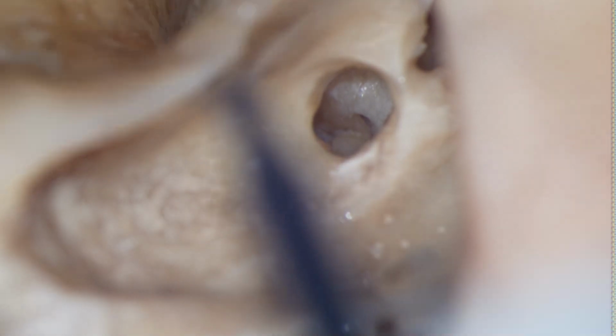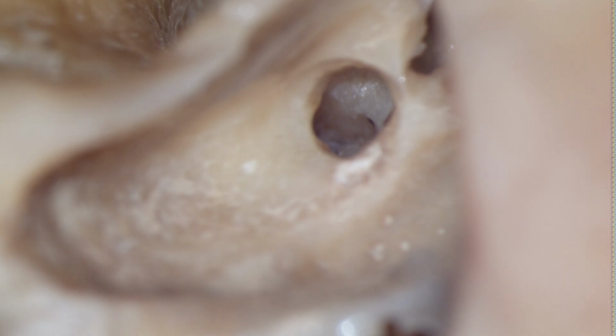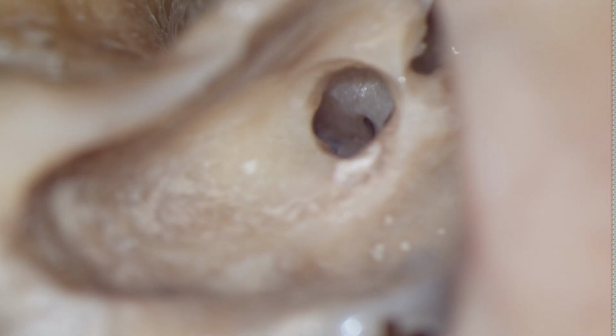Okay, so we'll stop here. I think you can start with the dissection. You can do a cortical mastoidectomy and do a posterior tympanotomy and identify the round window membrane, and then you can do a posterior canal wall down mastoidectomy.